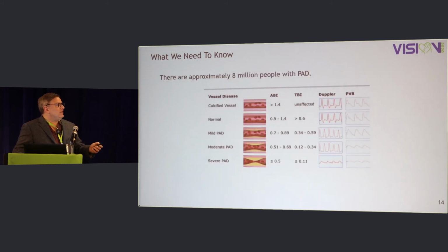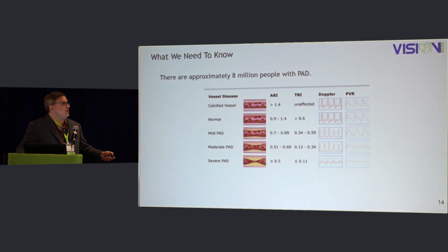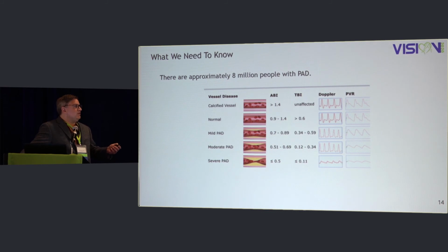I want to talk briefly about arterial disease. I've got 2 minutes. So we start with a triphasic wave pattern. We have the brisk upstroke in systole. In diastole, we have an initial dip with reversal of flow, and then some forward flow in later diastole. Remember, this is a high resistance network in the extremities, as opposed to a low resistance bed like renal flow, which would have a long diastolic flow.